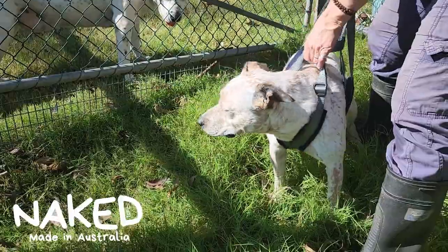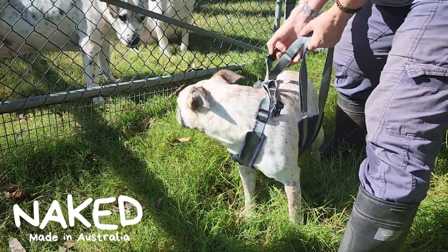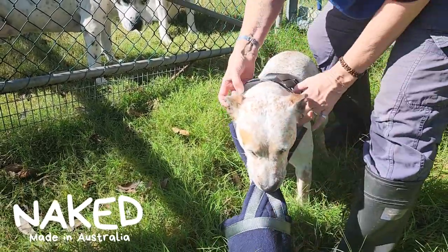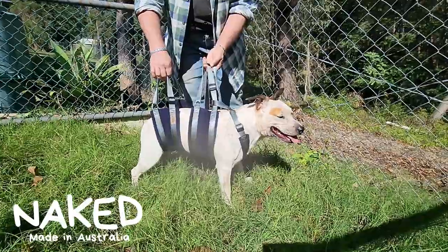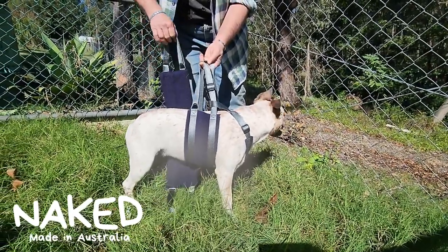There's lots of padding on the chest at the front, which helps the dog when it's actually lifted off the ground, so there's no pressure around the neck. To remove the front piece of the Naked Lift Harness, you just drop the flaps, bring the side flaps through the front of the arms, and remove it over the head.